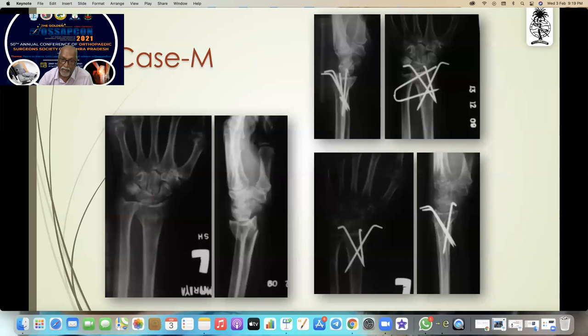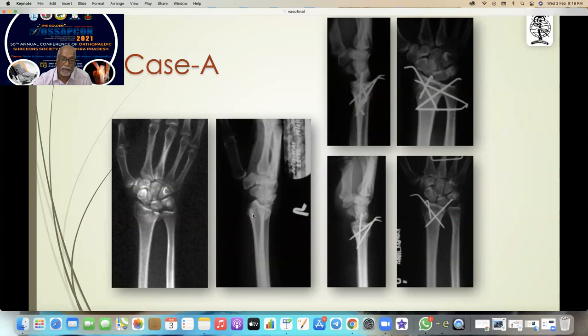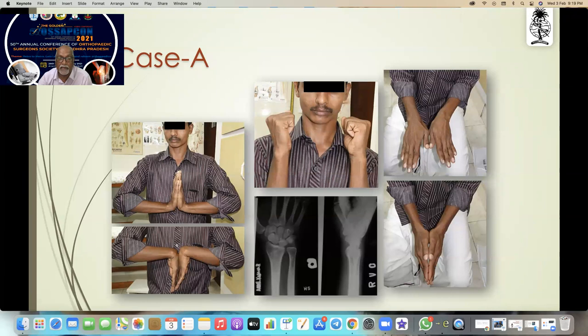That is the X-ray after three years. This is another case — you can see this intra-articular fracture where all columns are fractured. You can see the function. Another one which is a very far distal fracture — if fracturing at that level, the wire should go to the subchondral area and stabilize it. That is the result after three years.